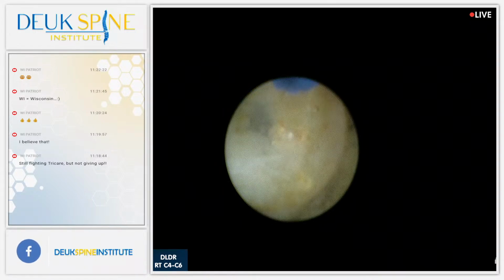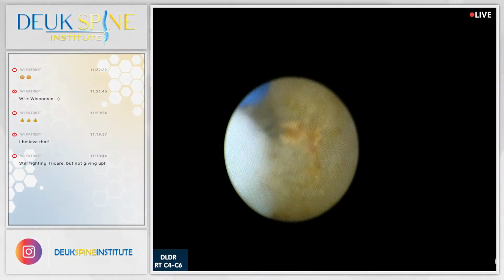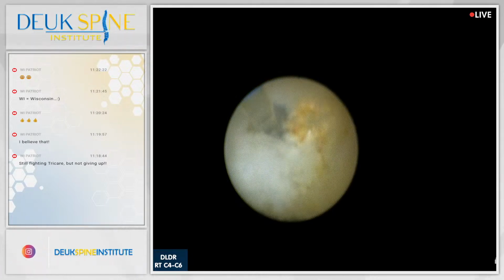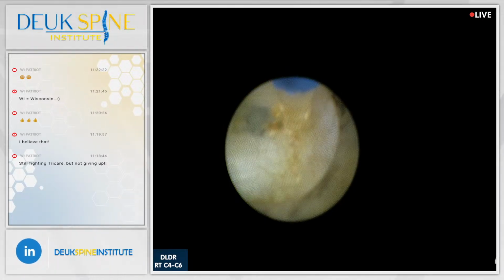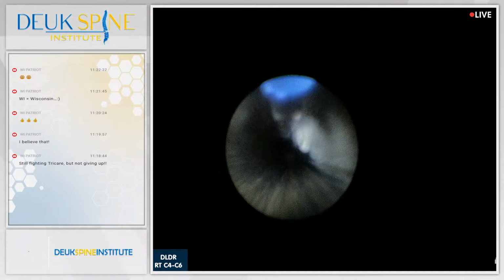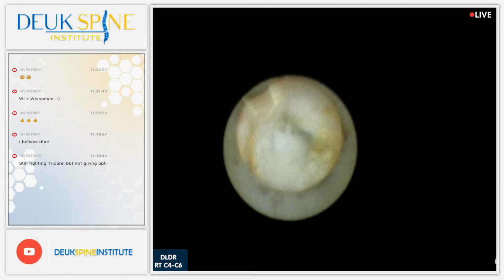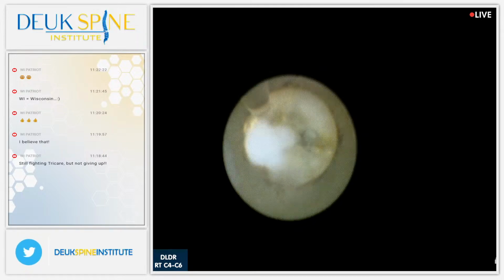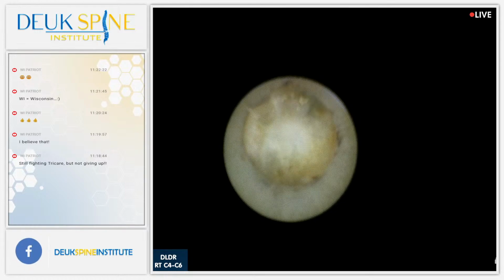That's scar tissue right here from all the inflammation, all the years of inflammation. There's calcium. Calcium takes years to lay down like that, okay? It's like a diamond, right? Diamonds take like, what, 1,000,000 years to be made, or 100,000 years, whatever it is. It doesn't happen overnight. All this stuff, scar tissue, calcium, takes years. This problem's been going on for many years for this patient.